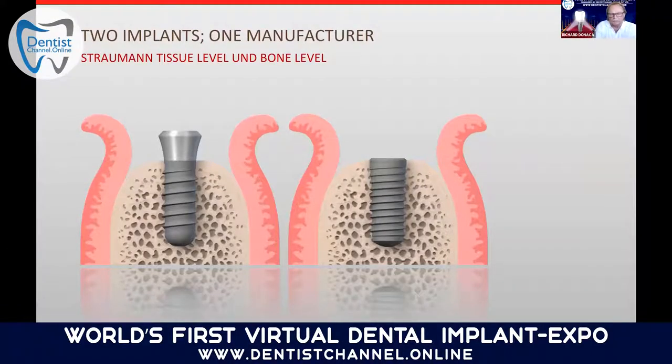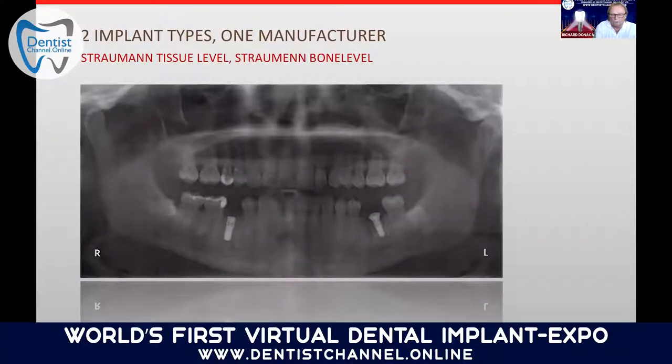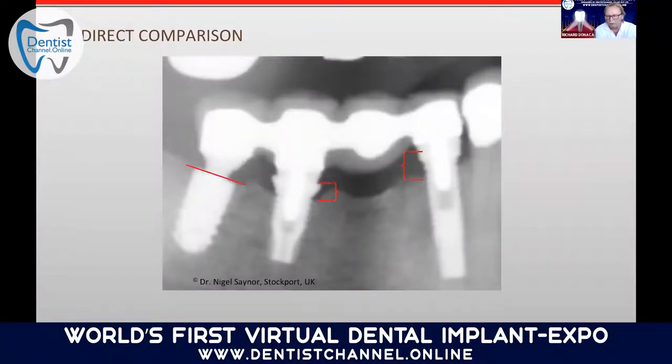These are the implants, one at a tissue level, one at a bone level. Both implants are comparable. Both implants are from the same implant company, but both have a problem in that they do not protect the implant abutment connection to avoid bone loss. Whereas you can see here, there is a conical connection from another manufacturer which upholds the bone retention and soft tissue retention.